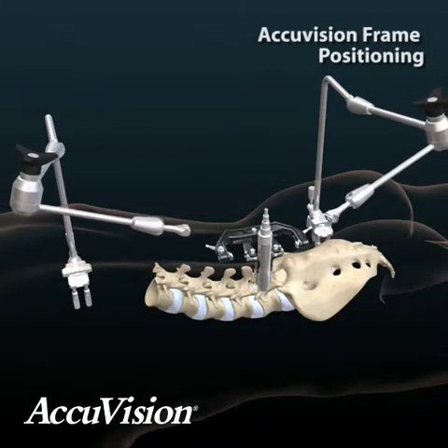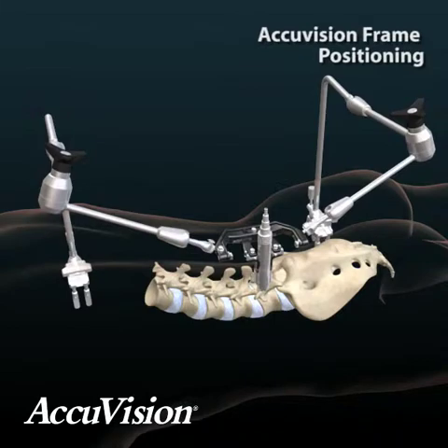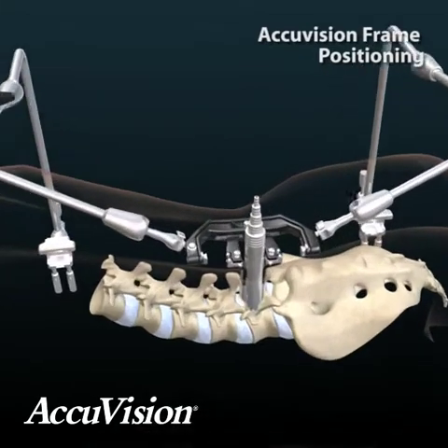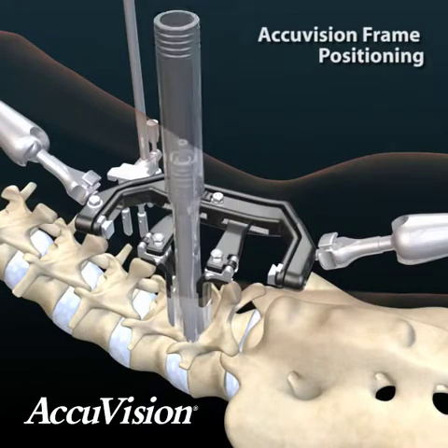Upon verification of positioning, the frame is secured into position by attaching the distal ends of the articulating arm to the posts of the frame. The sequential dilators are now removed from the patient.